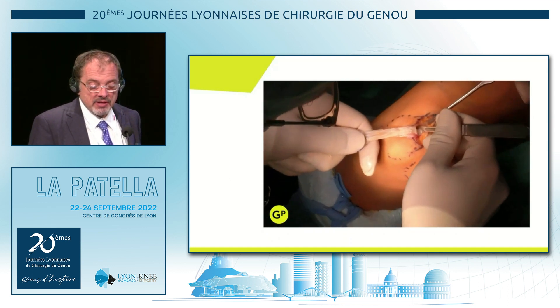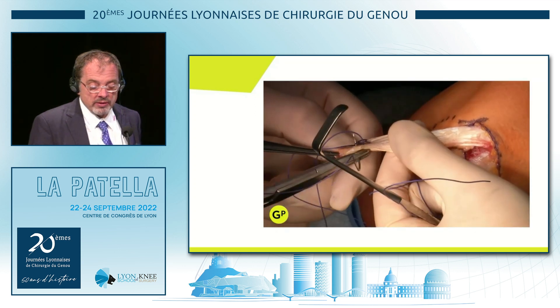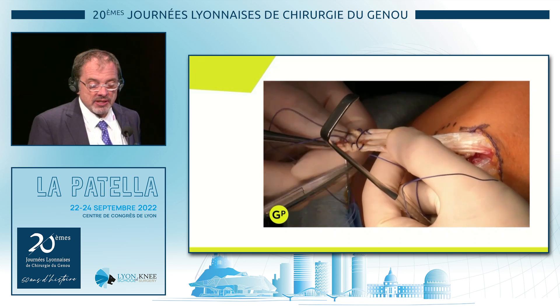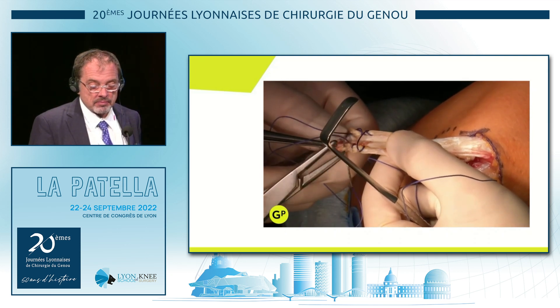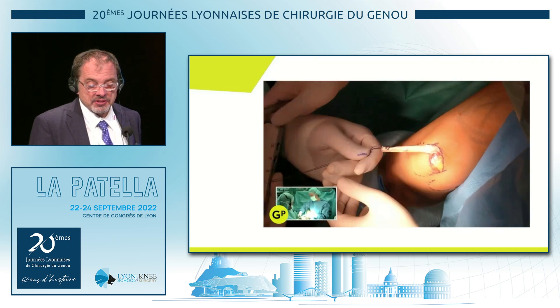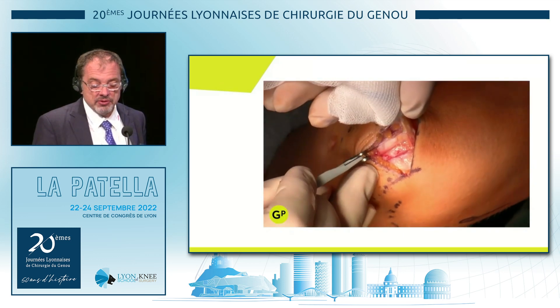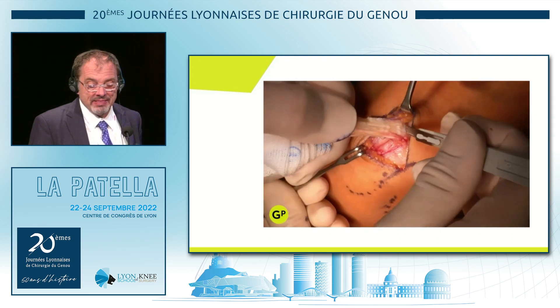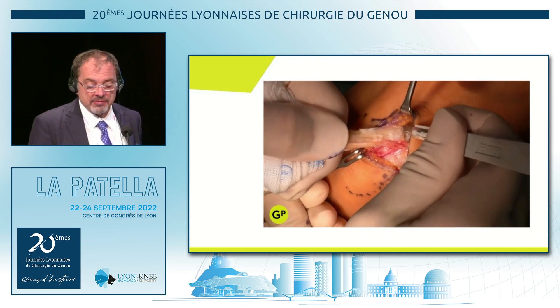Here you see the preparation on the patella. You prepare down about 1 centimeter. You put the resorbable stitches in the end of the graft. Then you measure the size — fixation with the screw. This is the preparation on the patella, because you really want to get it at the insertion of the MPFL.